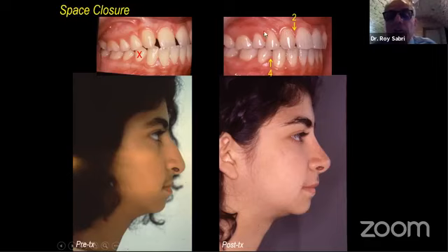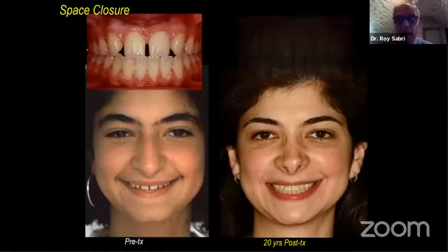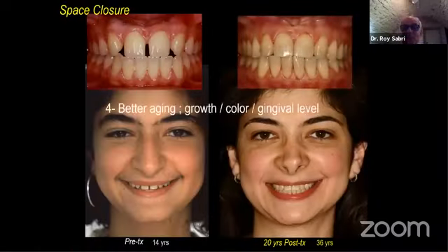Okay, so the gingival level is fine. Here, the first premolar was extruded. The profile is improved. She did a rhinoplasty. And here she is 20 years post-treatment. And that's what I want to show you. In 20 years, you change.